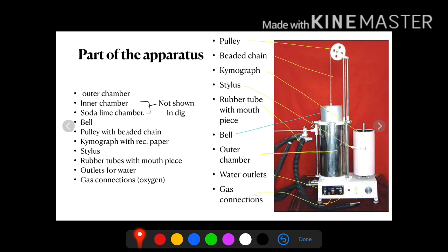Gas means oxygen. The patient or subject will have to take inspiration and expiration through a closed chamber where there is oxygen only. The inner chamber should be filled with oxygen — that is why these two knobs are for gas connection.